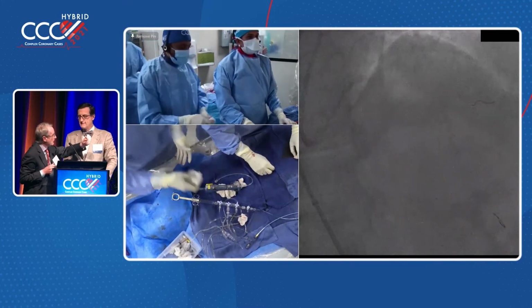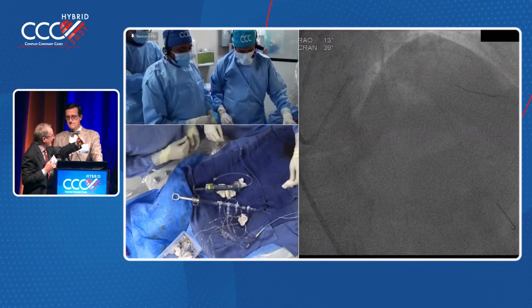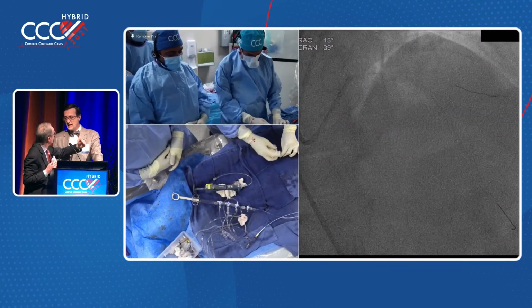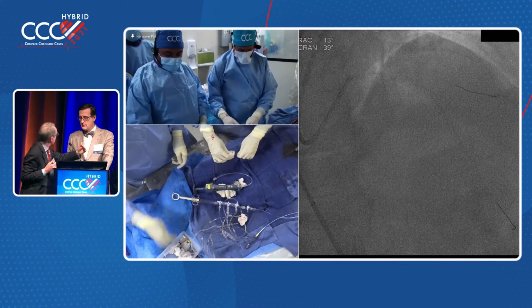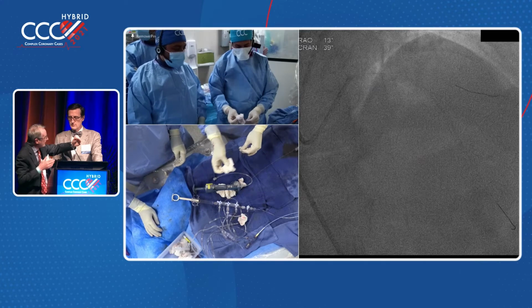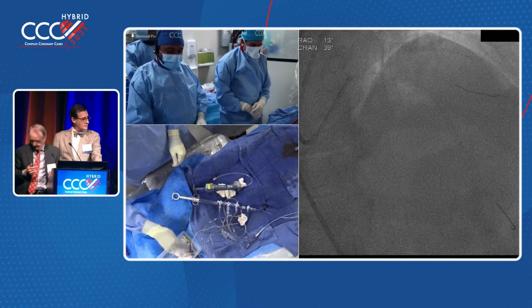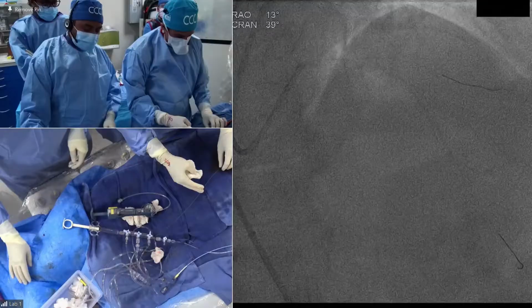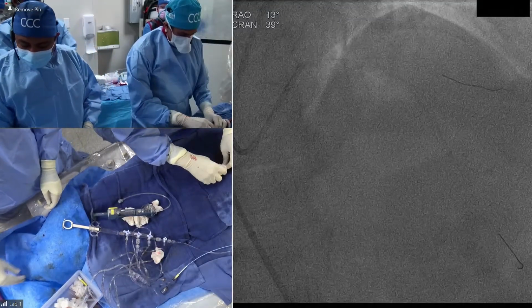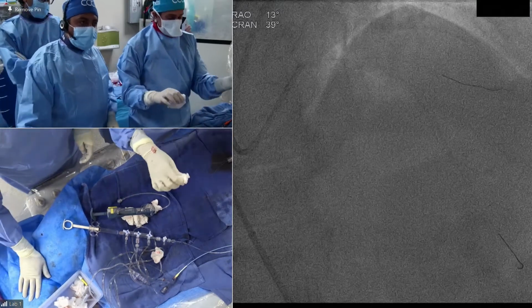Yes, and the balloon will not break because it's soft and will create bias of the burr. You mean not inflated balloon? Inflated. And will push the burr toward the calcium and bias and cut the calcium. So it makes it even more directional. It's directional, intended to be directional. Exactly. It's a directional, rotational attack.